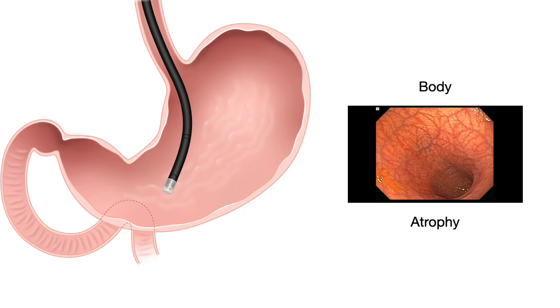Yeah, you may say it is colon, because colon has these submucosal blood vessels that can be seen. But if you see the same thing in the stomach, you should suspect gastric atrophy or autoimmune gastritis or pernicious anemia. If they develop vitamin B12 deficiency and develop anemia, that is pernicious anemia.